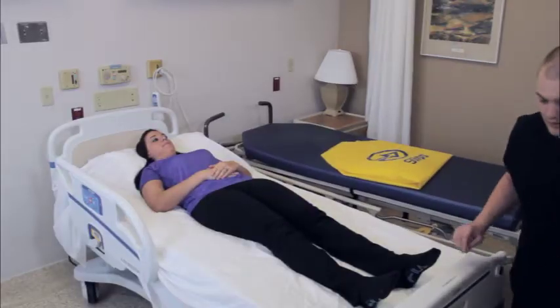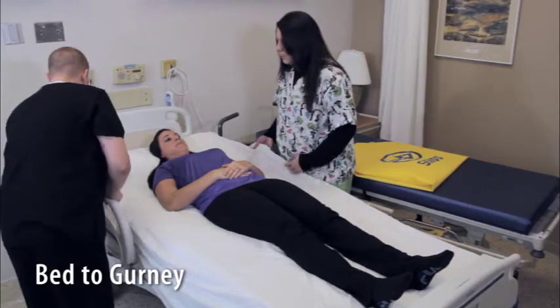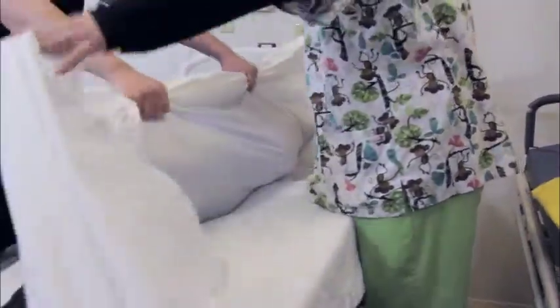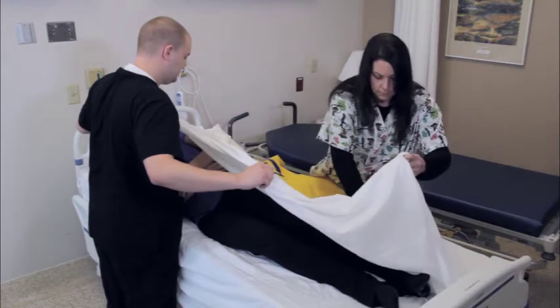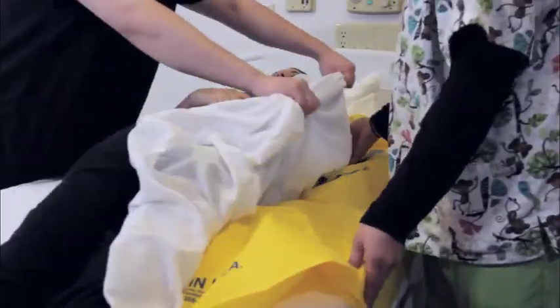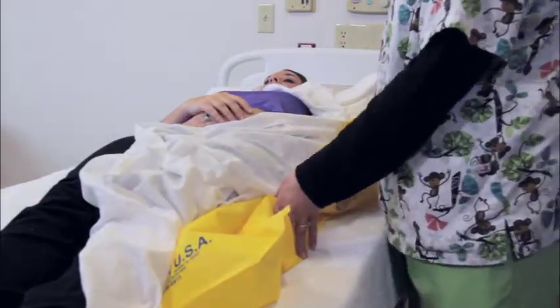To transfer a patient from bed to gurney, begin the move by lowering the rails on the patient's bed and the gurney. With the patient lying on her back, roll the patient onto her side away from the direction in which she is to be moved. Place the Slip under the draw sheet next to the patient. Then, carefully roll the patient back onto the sheet and the slip. She is now in her original position lying on her back.